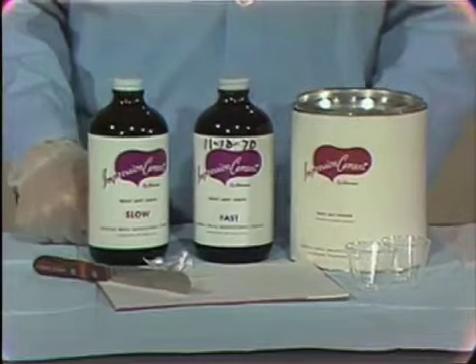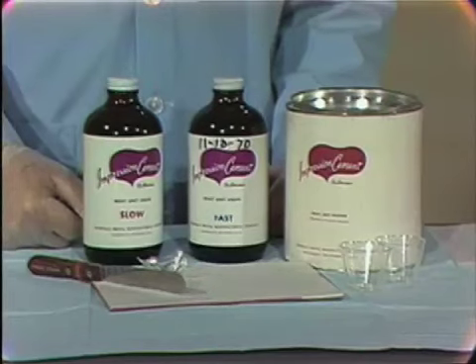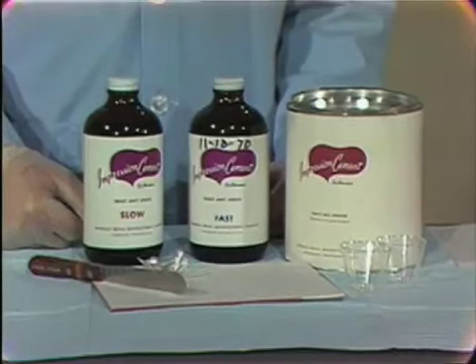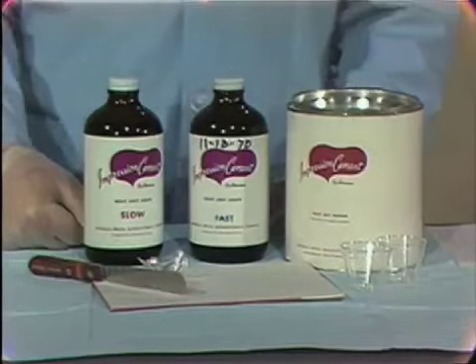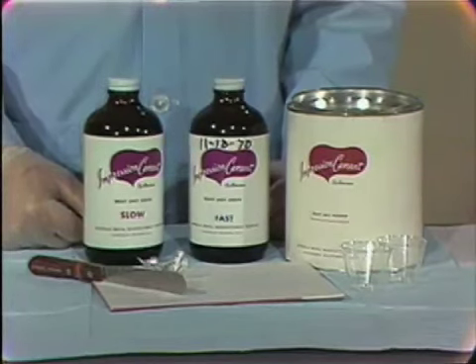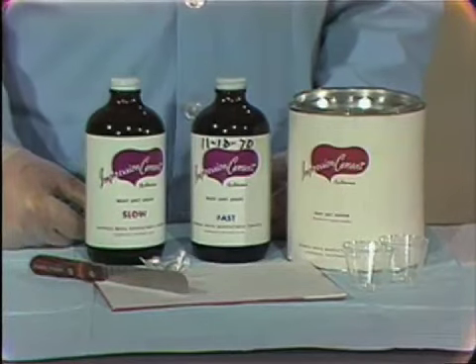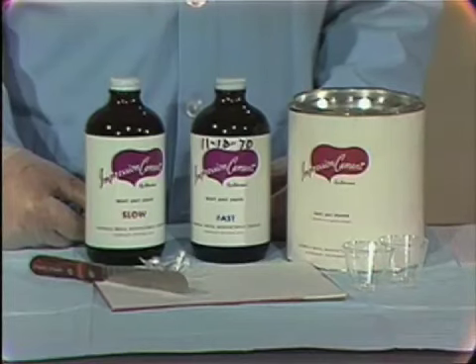Now, it's good to make several trial practice mixes of the material until you're familiar with handling of the material. The material should set hard, and a zinc oxide eugenol material does set hard. It should set hard so we can put the impression back in the mouth, check the stability of the impression material, or the stable impression, before we make the base. Then the material should be compatible with the laboratory procedures, which would allow us to pour a refractory material into it or a stone model from which to make our casting.